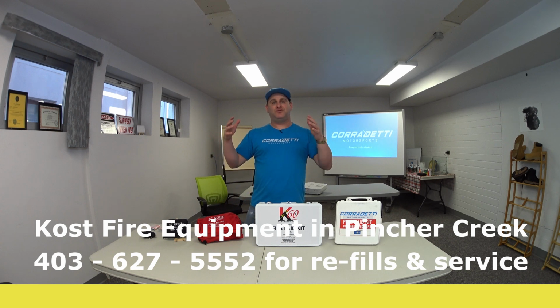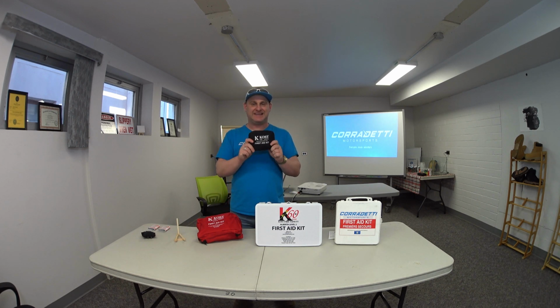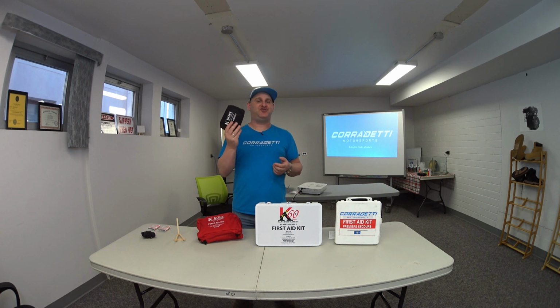Now going over to the legislative part of it, which is our first entry level, is a P. Now the P stands for your personal first aid kit. It's a very small kit. It has very limited resources in there, and it's just designed to do light first aid care on a single casualty. So if you have 2 or 3 people going out, this will not be suitable for it. In the workplace, it's just for one worker. The P is good across the board if it's in a low, medium, and high risk situation. Again, distant work or whatever, the P will be classified as acceptable.